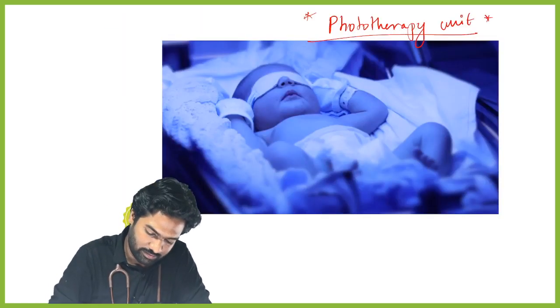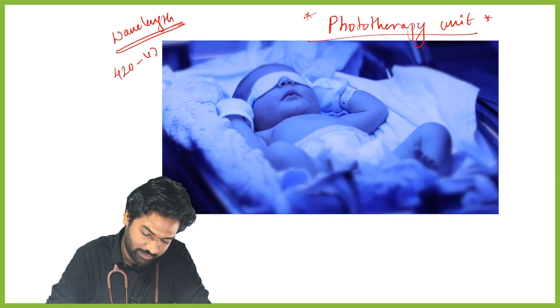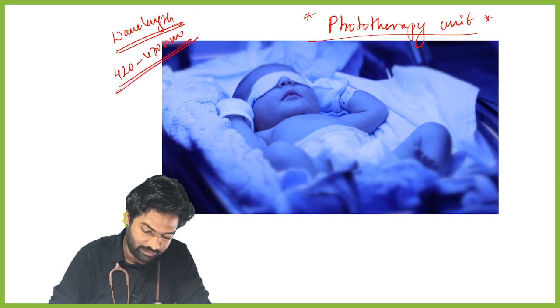A repeatedly asked question is the wavelength. What was the wavelength of the phototherapy light, the blue light? It is around 420 to 470 nanometers. This is a CET question.